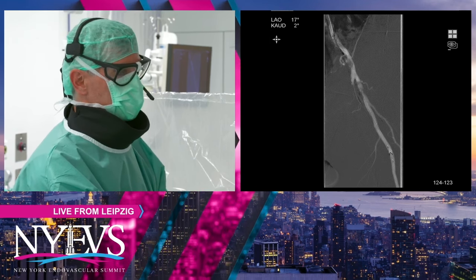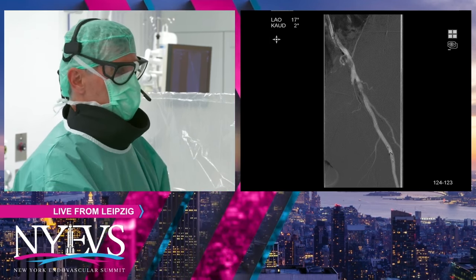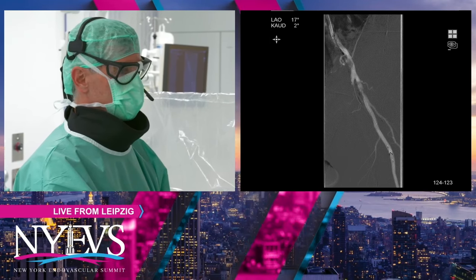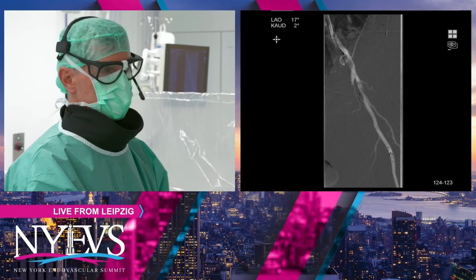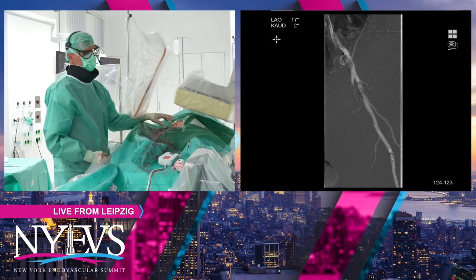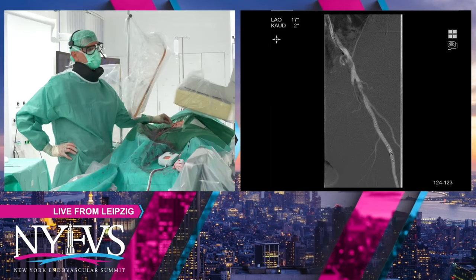But I think it's not a mistake here to later on balloon aggressively and take a short stent into that proximal common. What's your thought on IVL versus Jetstream in this situation?